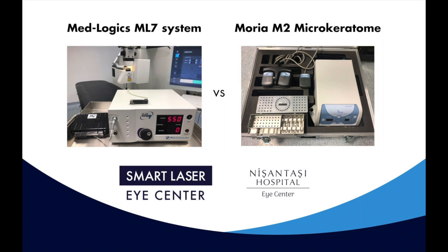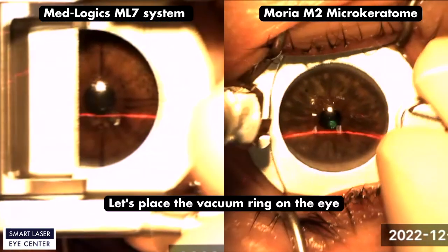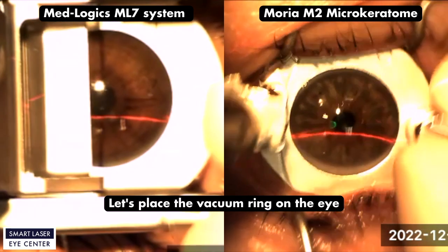In this study we will compare two different microkeratome systems at the same time, and we will share the surgical performance and biomechanical results with you. On the left is MedLogic's ML7 model, and on the right is Moria's M2 model.